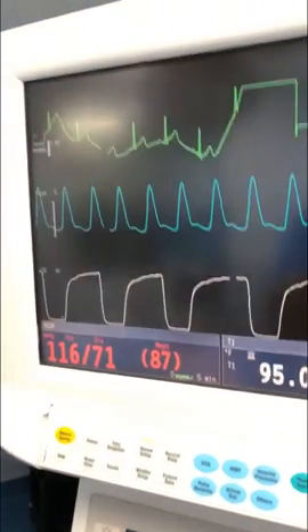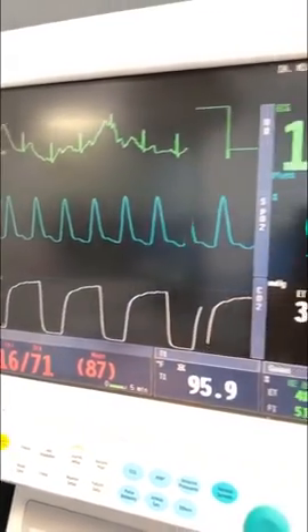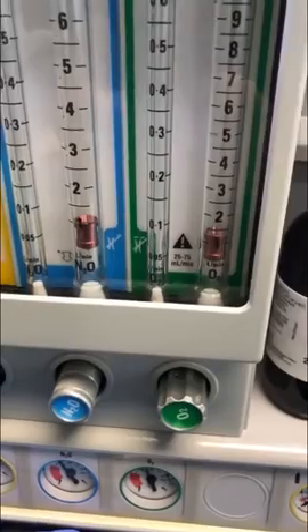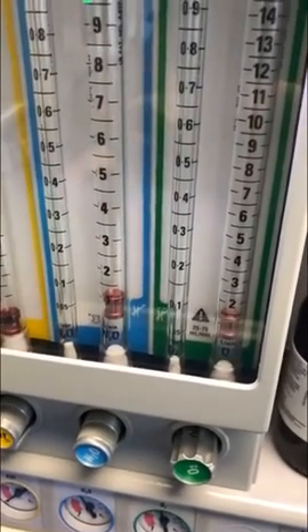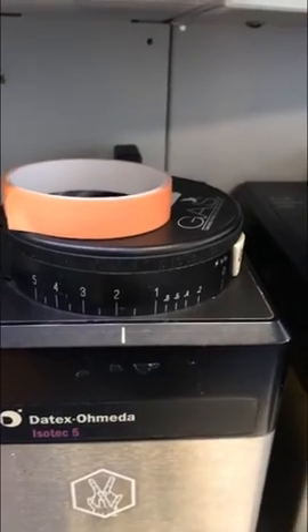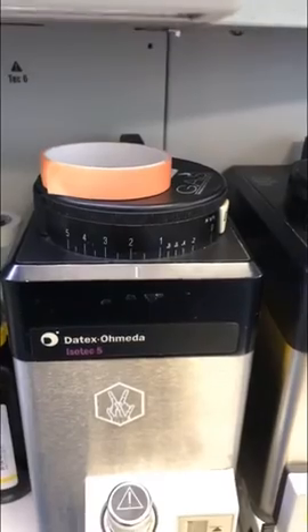So we're just a few minutes from induction and her vital signs have already settled down into a really nice pattern. I'm really pleased with that. Our ventilatory support is just about where I want it. Gas flows are one-in-one — that's 50% nitrous, 50% oxygen — and we're at isoflurane just under 2%. I'll probably leave her there for a while and see how she rolls. If I need to adjust it, I will.